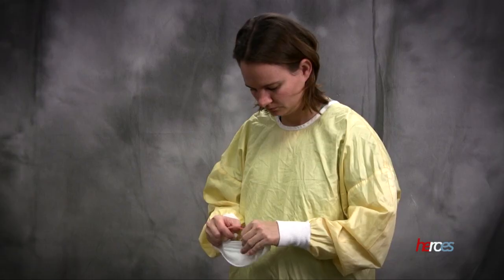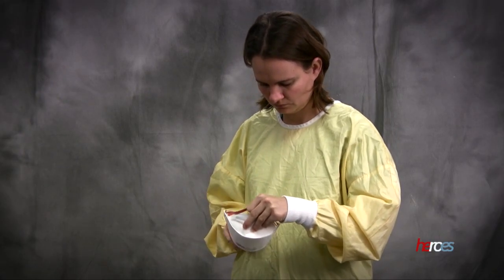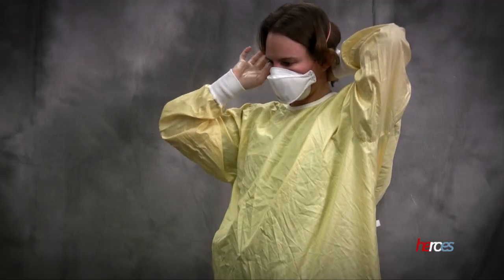Respirators can be shaped to fit the face or be folded. Folded respirators are applied in a similar fashion, ensuring that the respirator is fully unfolded and has a tight seal with the skin. Again, breathe deeply in and out, feeling for any areas where air may be escaping along the edges.